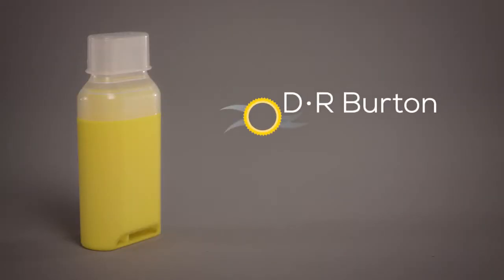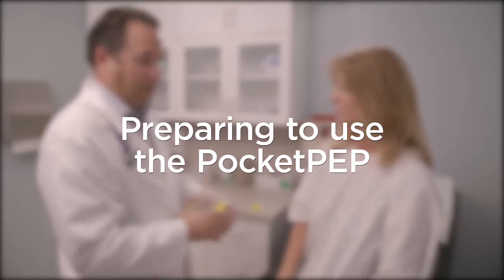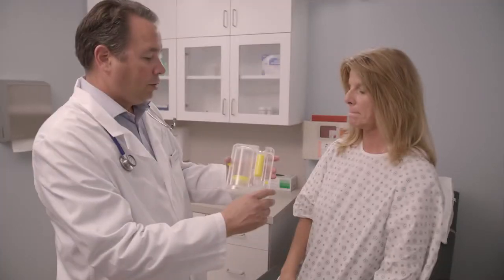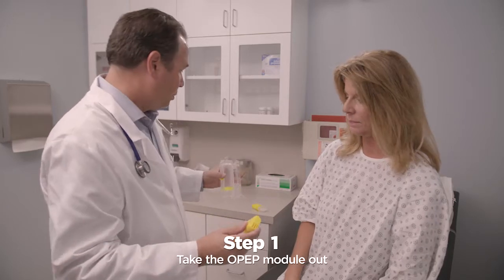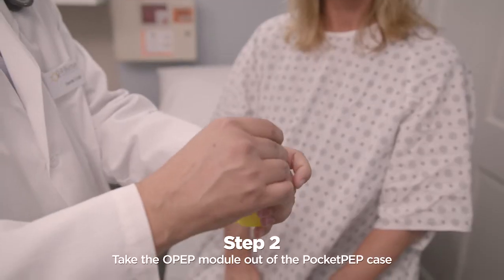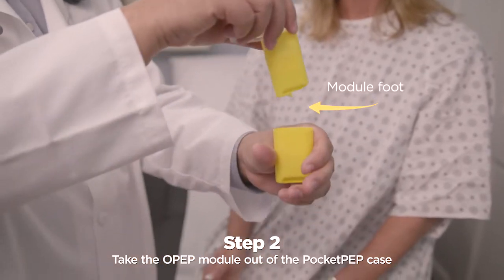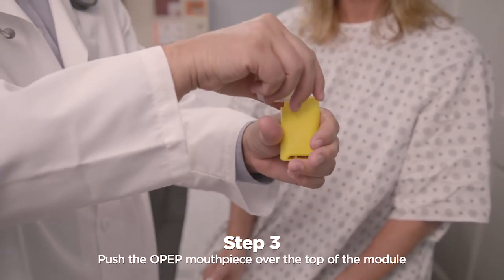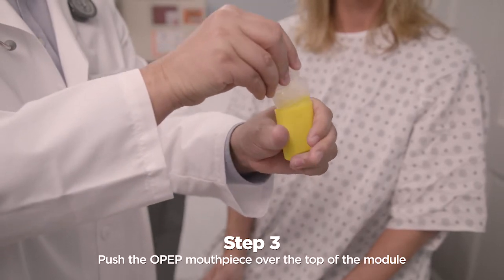Some of the IPEP parts can be used to make a smaller device called the pocket PEP, which you can use to continue your treatment at home. With the back of the IPEP facing you, take the OPEP module out by pushing down on the vents and out towards you. Put the OPEP module in the pocket PEP case, making sure that the module foot goes in first. Push the OPEP mouthpiece firmly over the top of the module and push until it clicks onto the case.